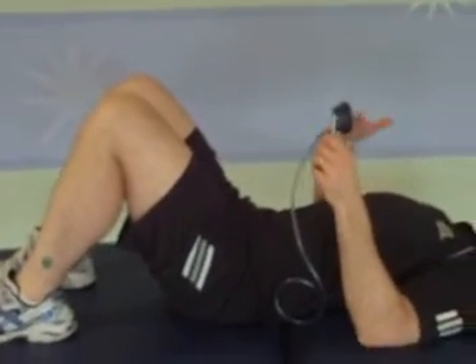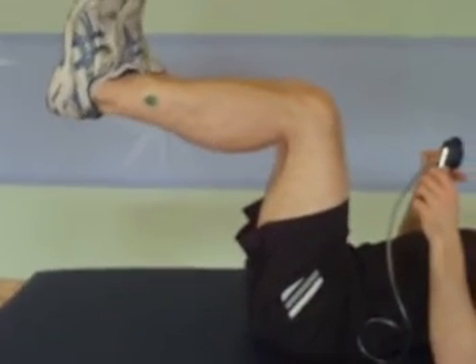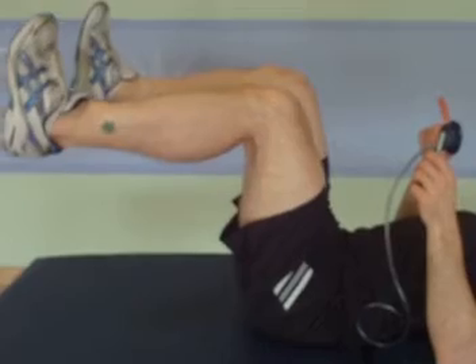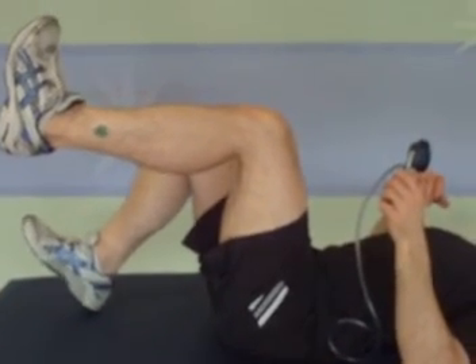And if they do well there, we'll go to the next level. The next level is we're going to bring both legs up in the air. Keep that neutral position to the spine, abdominal drawn in, and lower down one leg at a time. Again, trying to keep that dial as close as you can to number 70 and then four ticks on either side of the 70.